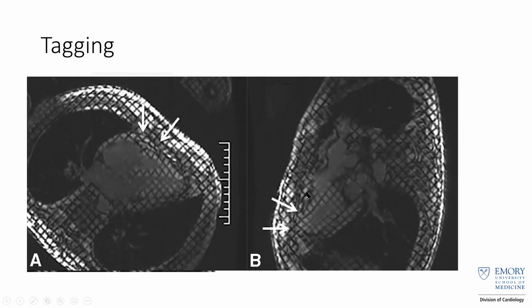So this is helpful, and there are certainly other things that you can do. You're looking for ventricular interdependence, and you do some free breathing images for constrictive pericarditis as well. It's not the only thing we use, but this is helpful to see where the pericardium might be adherent to the myocardium.